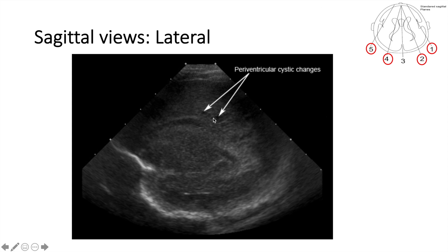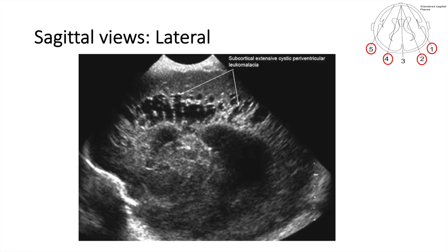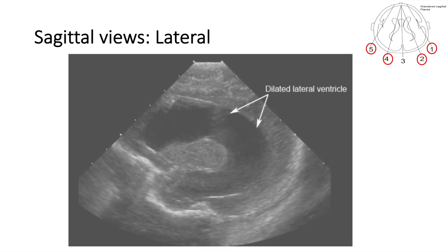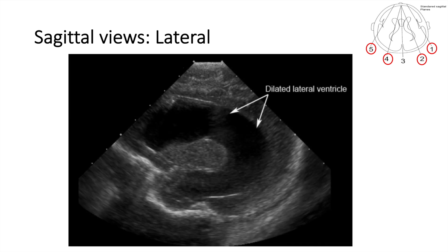We're starting to see a few cysts here, which represents PVL or periventricular cystic changes. This is a much worse picture representing extensive cystic periventricular leukomalacia. We also look at ventricular dilation — this very dilated ventricle most likely represents post-hemorrhagic hydrocephalus.